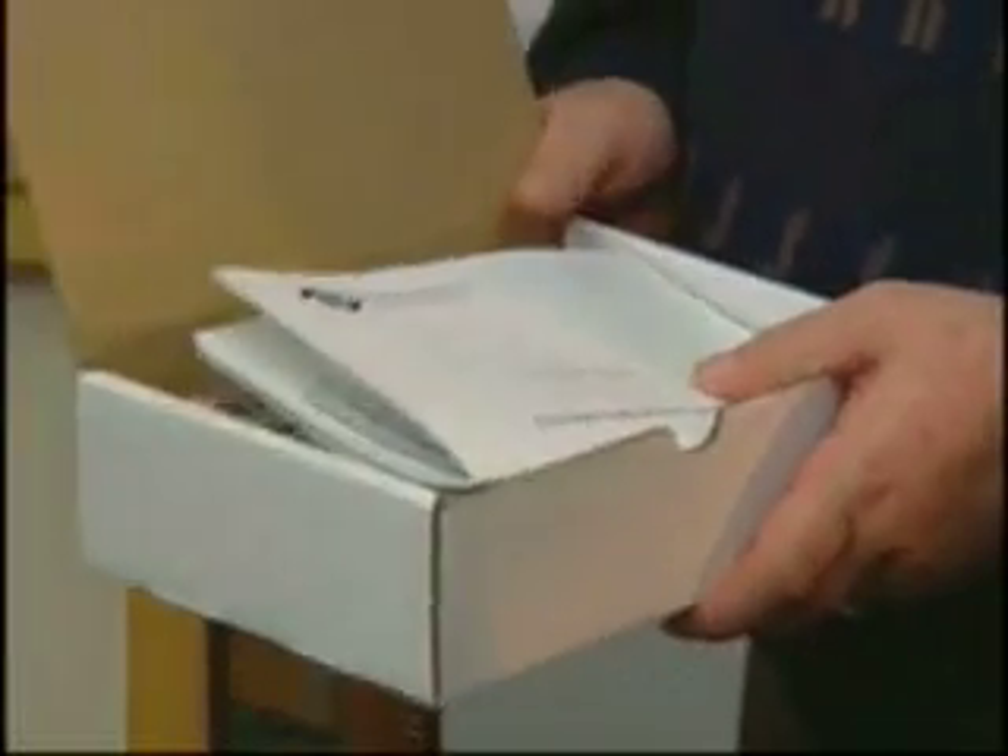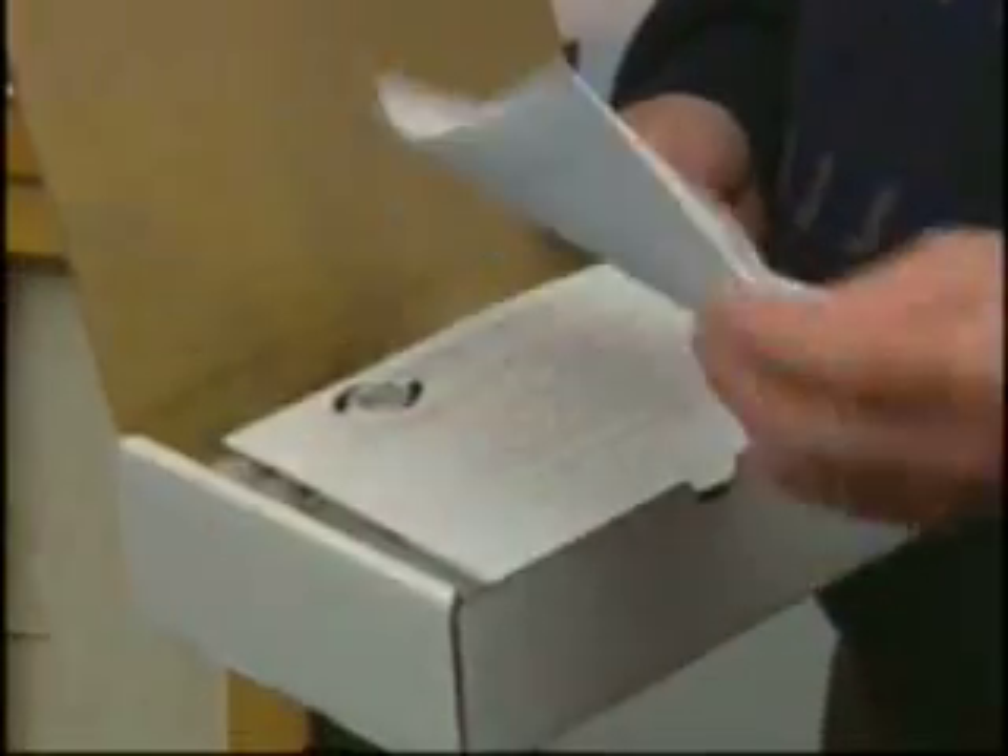When you receive a flex-trodes package, it'll come in a box like this. You'll have the documentation enclosed and a packing list so you know exactly what you've received.